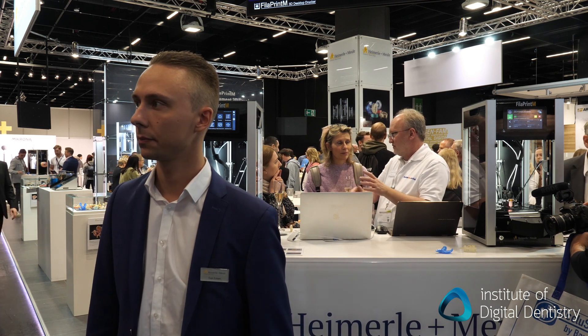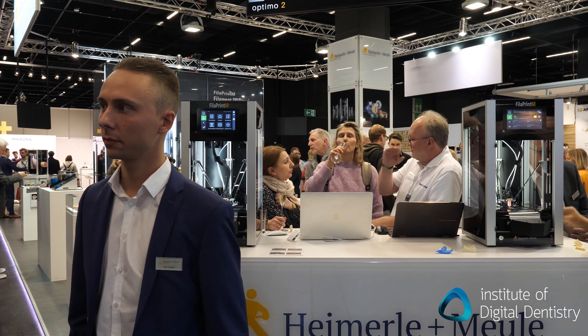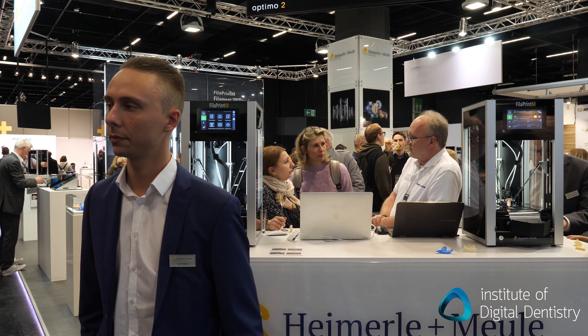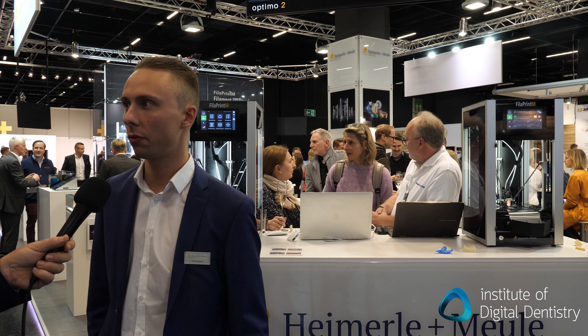Can we do implant surgical guides with this? Yeah, sure. Because you've got the automatic ejection and reprint, it's going to allow you to keep that going all day long, 24 hours, right? That's right. So you have a continuous print, and if one piece, for example a tray, is already printed, you can use it and you don't have to wait for all the pieces to be printed.